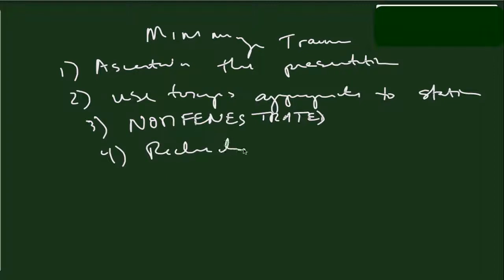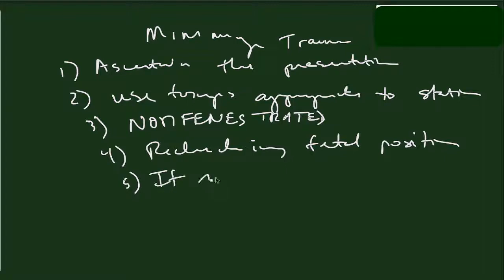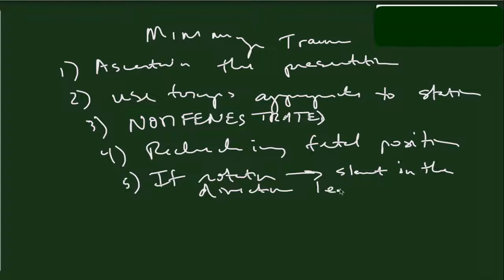Rechecking the fetal position once the forceps are applied. And if rotation of the baby is attempted, to at least start in the direction where there will be least rotation of the spine.